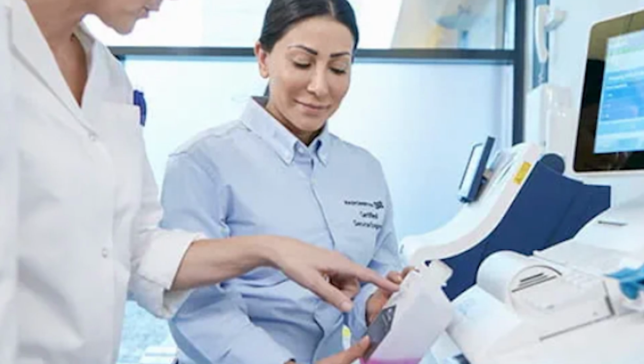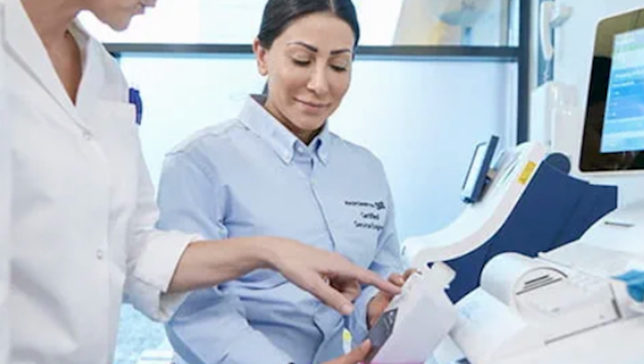But if it is in the range, then it's okay, and you have proven that the machine is good for patient testing, reporting, and most of all, to act upon the patient. So in other words, treat them in whatever way you think is necessary. So that's what quality control is. But now we want to take a closer look at an ABG machine and how we introduce quality material, analyze the results. We also plot the data, and we can look at that and tell some things from that data. So let's take a closer look at that.